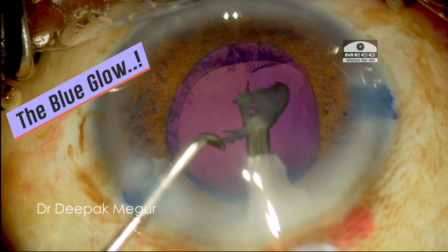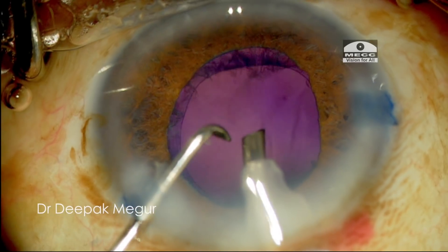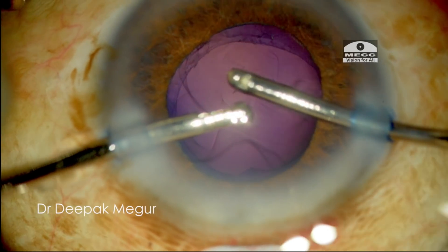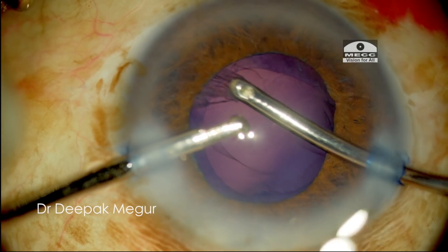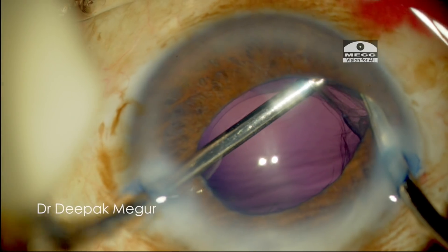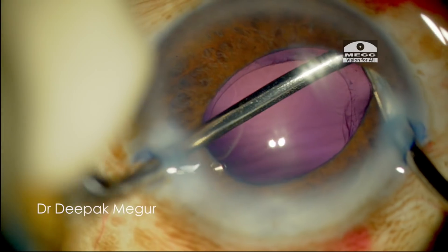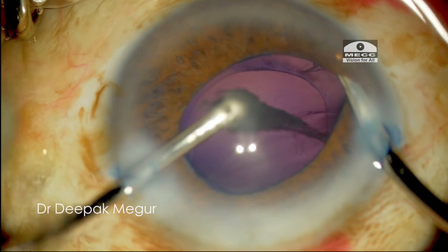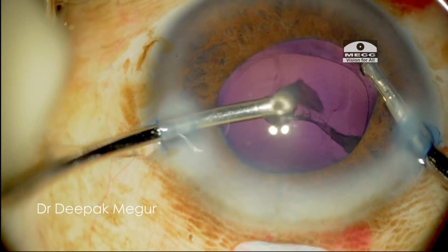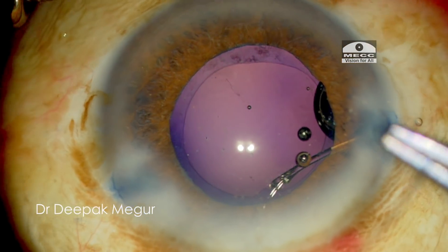The obvious reason is that the trypan blue has found its way into the vitreous cavity through the loose zonules. This reminds us of the fact that the barrier between the anterior segment and the posterior segment, which we so religiously try to protect, is in fact more in our minds than it is factually, at least in such cases. This phenomenon of fluid traversing across the zonules into the vitreous cavity is not common but can occasionally be seen in eyes with zonular weakness.